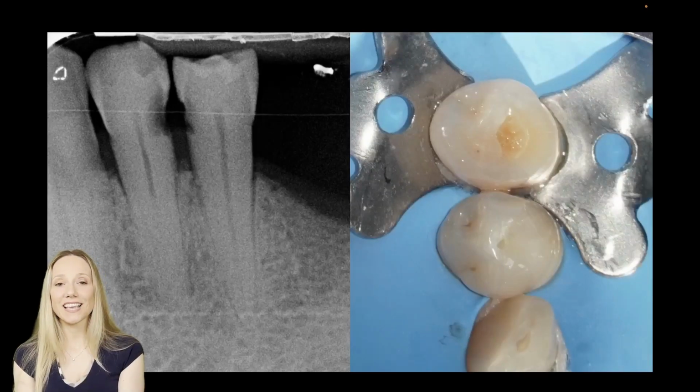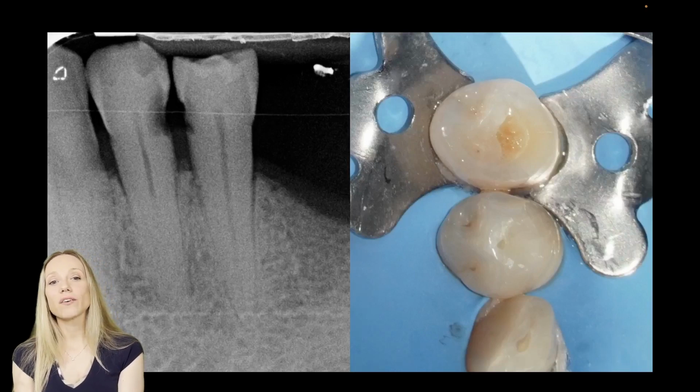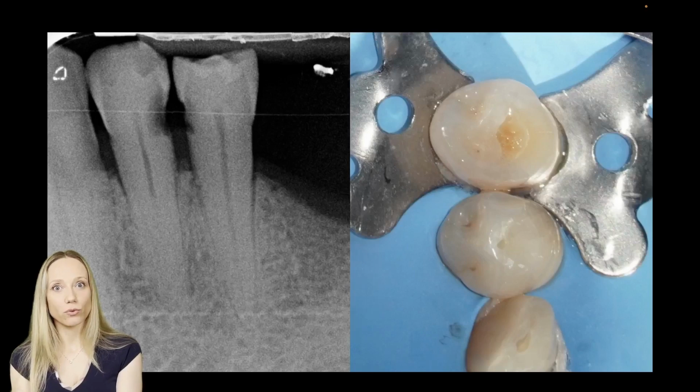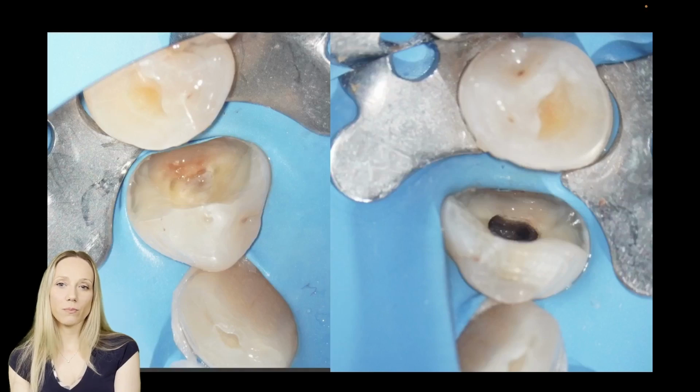And then one last case, another mandibular premolar, in which from the preoperative x-ray you could guess there is something that is not normal. In fact, there are two deep decays. I do a multiple isolation because I have to treat both premolars. I open my access cavity and what do I see? Two root canal openings.